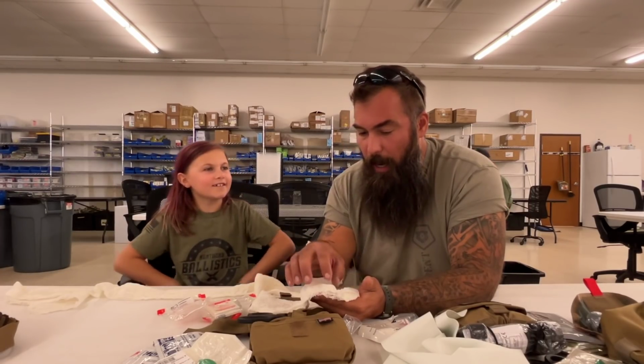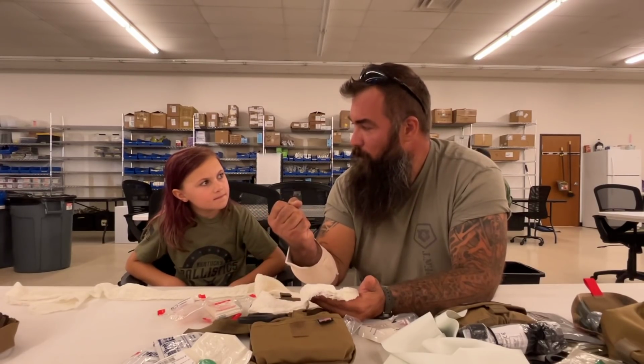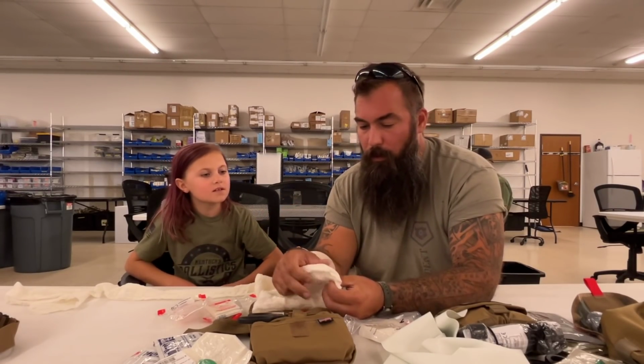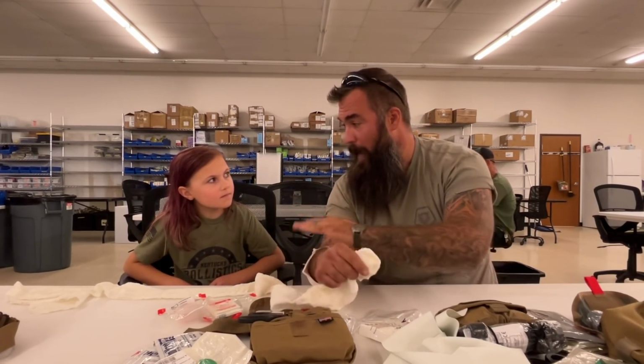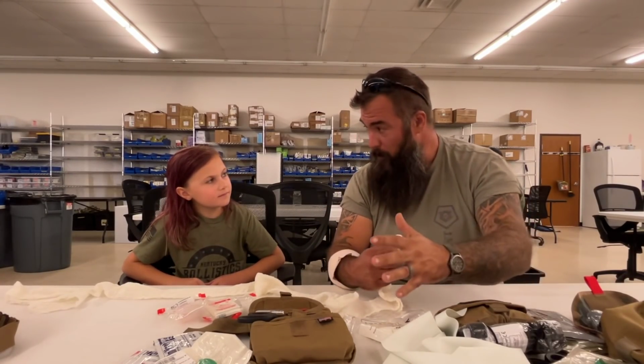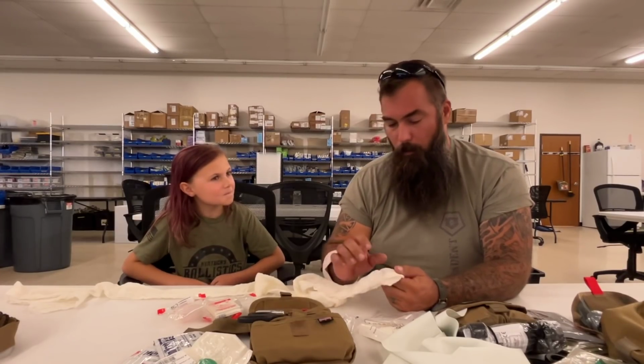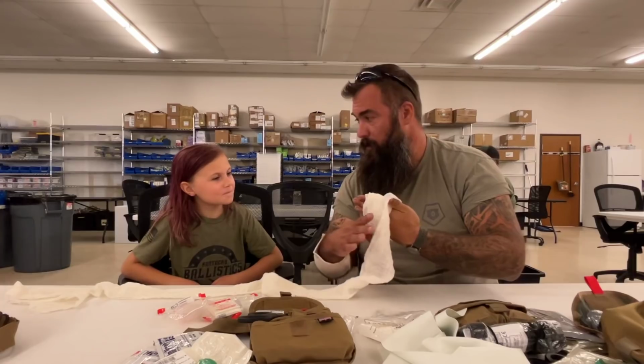And so that creates a high amount of surface area that allows that capillary action to happen. Yeah. And so we use this stuff for wound packing. Okay. We can shove this into holes in people's bodies when they're screaming, and suck it up, buttercup, you stick this in the hole. We can also use this for wrapping up injuries if we have them.